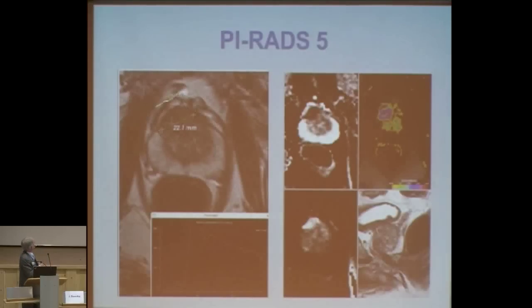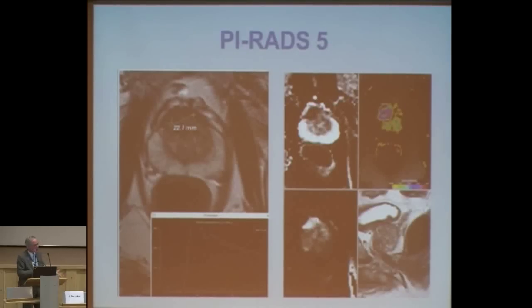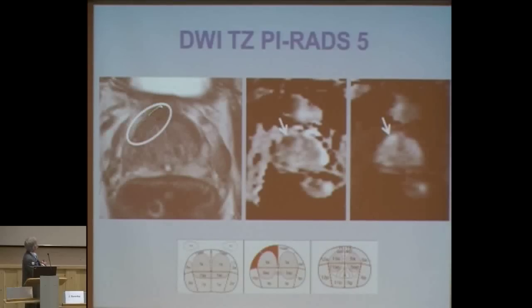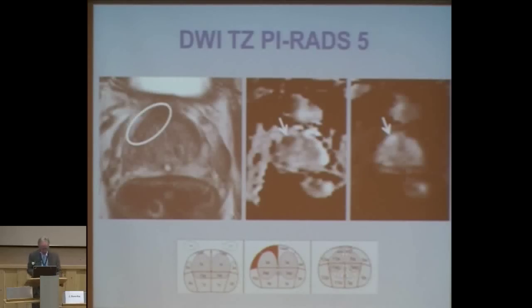This is a lesion anteriorly located. It has an erased charcoal appearance — black and white on diffusion — plus pathologic enhancement. It gets five points; this is surely an aggressive anterior tumor. A more subtle tumor: with circles drawn around it, you can see something going on, also black and white — also PI-RADS 5. Confirmed by histopathology as a Gleason 4+3 anteriorly located small tumor.